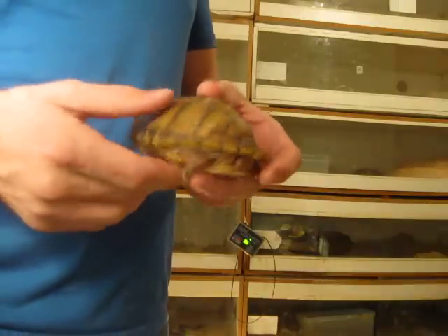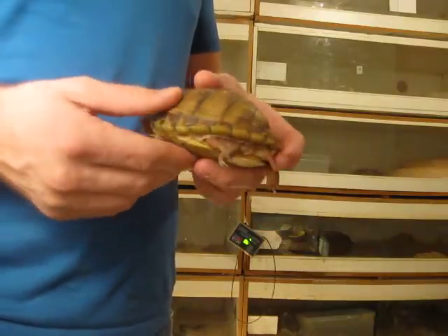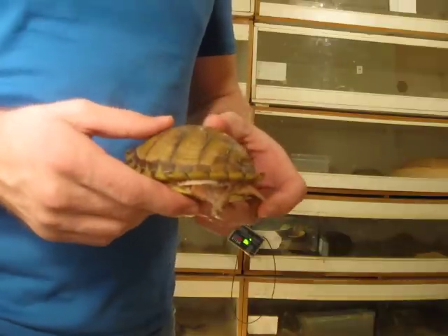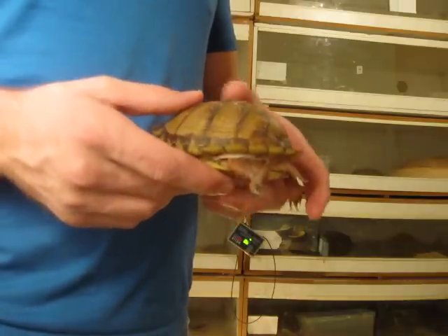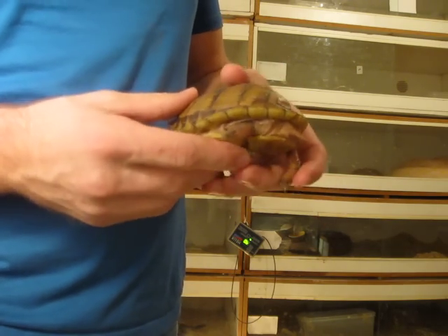What we have here is the male three-toed box turtle with the respiratory infection, and we're going to give it its first injection of Baytril. I do recommend going to a vet and getting the vet to do the injections, just so there's no mistakes on the dosages and where you're actually giving the injection.